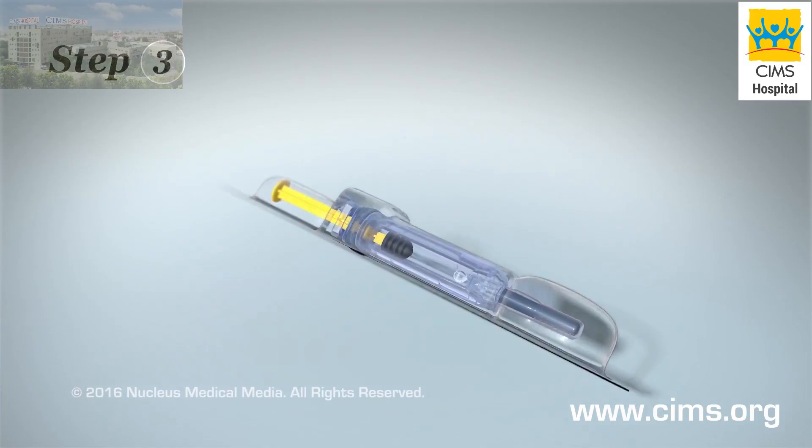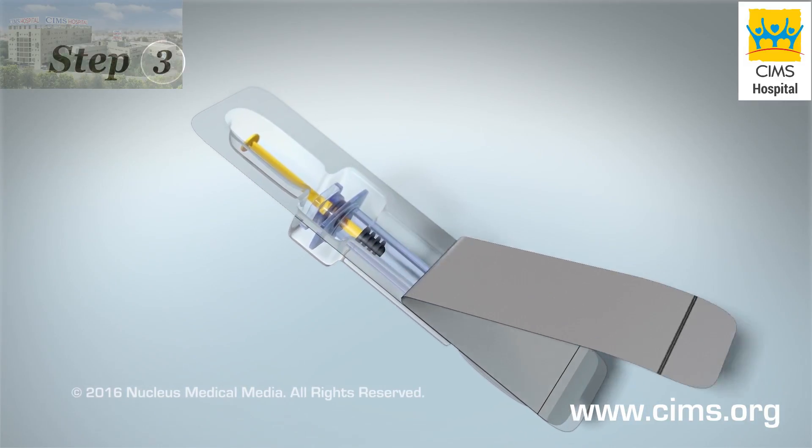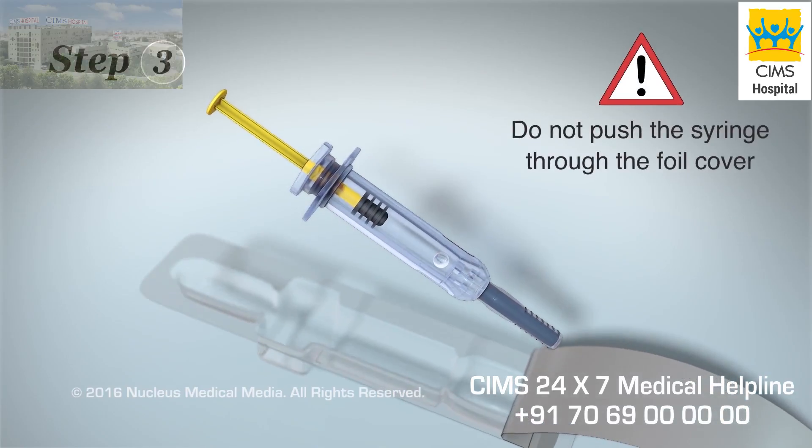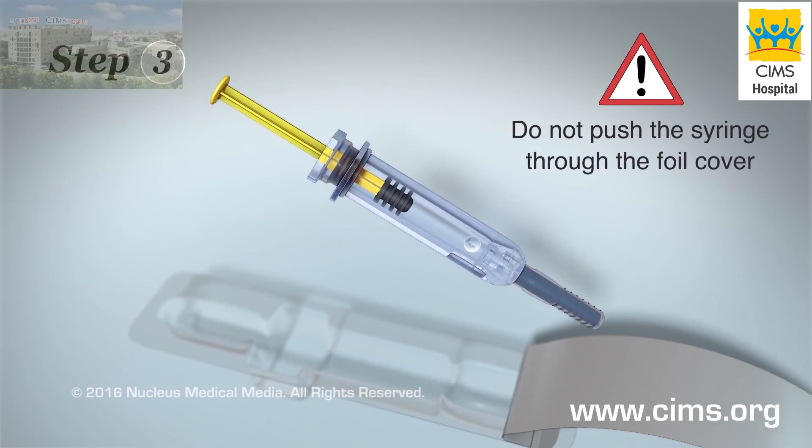Step 3. To open your syringe, peel the foil cover off the back. Do not push the syringe through the foil cover because it could damage the syringe.